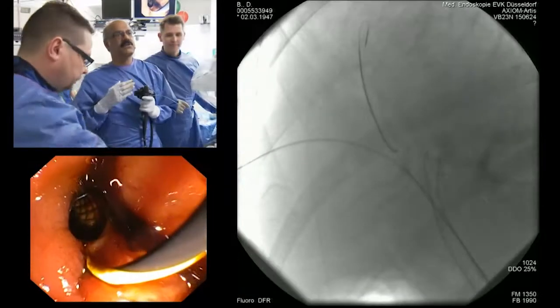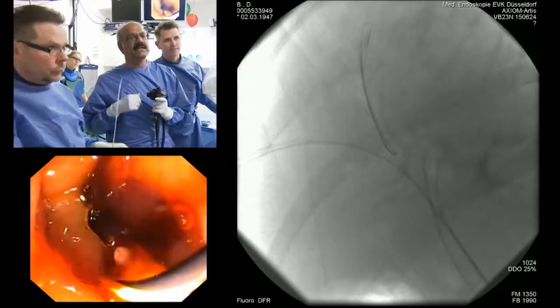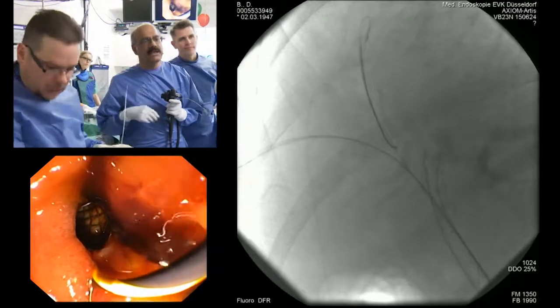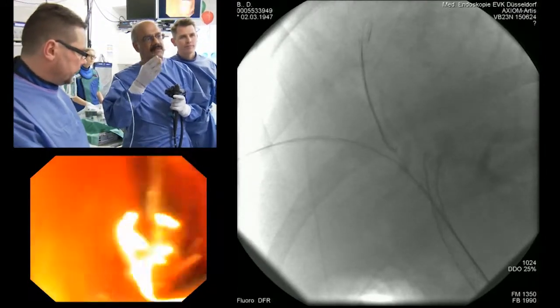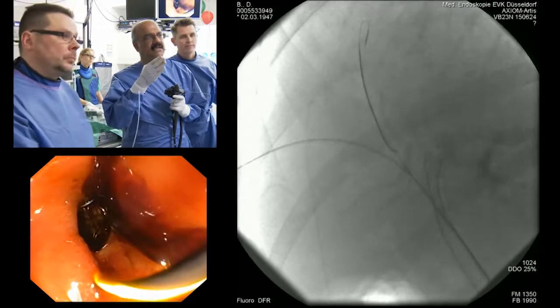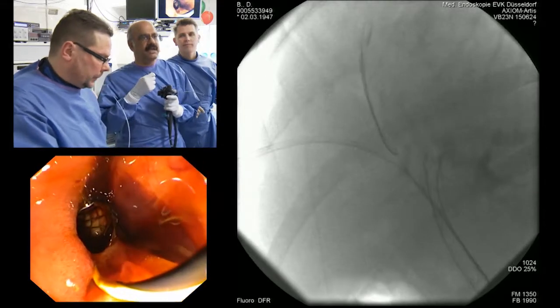This is the first run in our radiofrequency ablation of all the posterior and anterior segments. After we did that, we did a balloon dilatation using the Titan hurricane balloon. We dilated the left duct and right anterior and right posterior separately, which is very important. The right posterior was very tough.